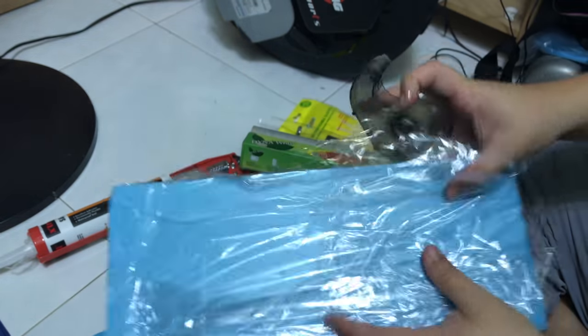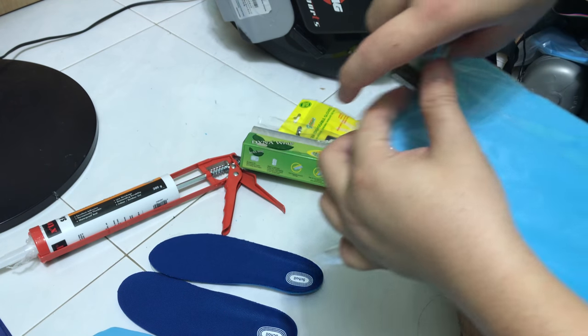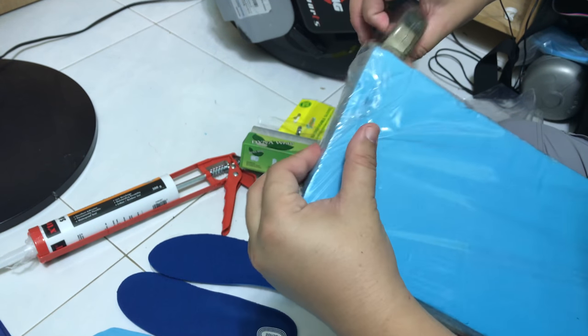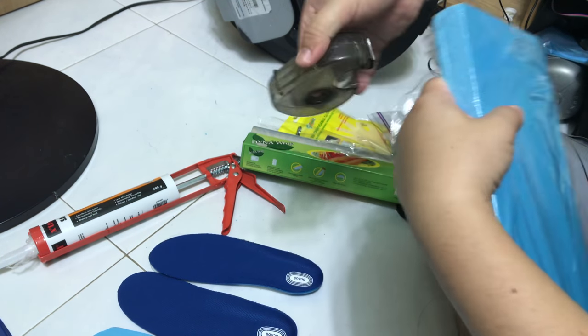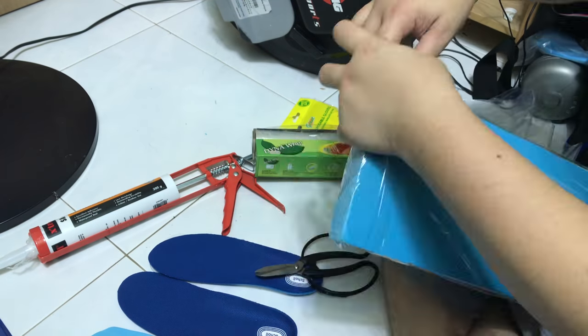Use some tape to secure the nozzle wrap because the nozzle seems to be a little bit loose. I need to make it secure so I use tape to tape it down.